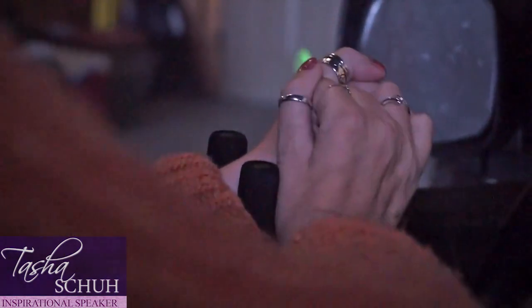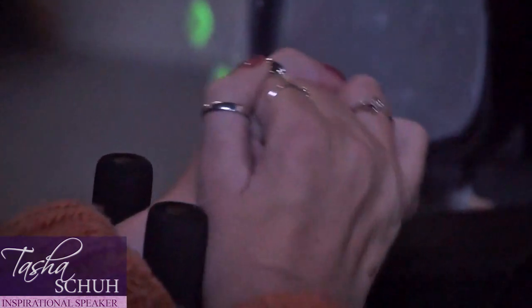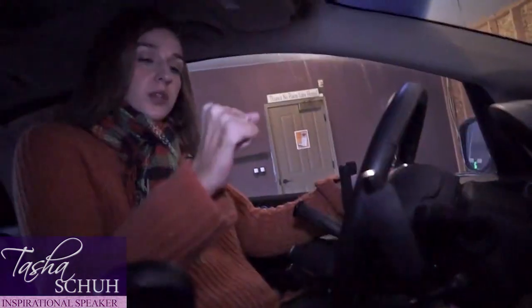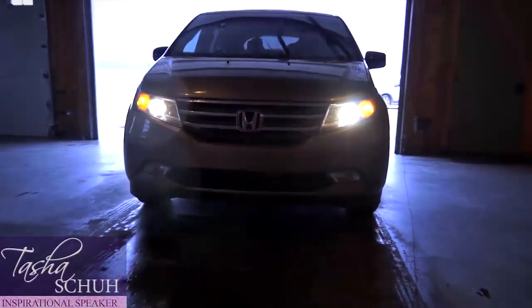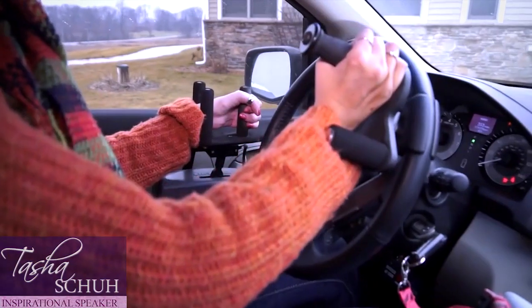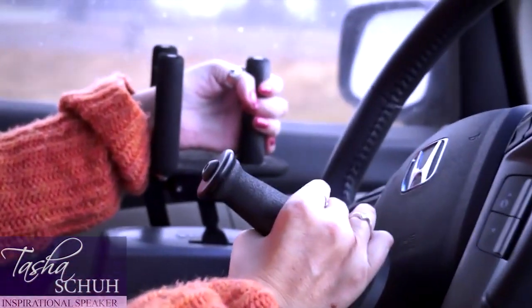Now I'm going to slide my hand down into this — it's actually called a tri-pin system, which means there's three pins sticking up so that once my hand is in it, it won't slide out. Again, I push forward for brake and I pull back for gas. To shift it out of park I pull this lever down. I have my brake on over here and now I will steer with my right hand. I back up and I actually have a camera when I have it in reverse so that I can see what's behind me.